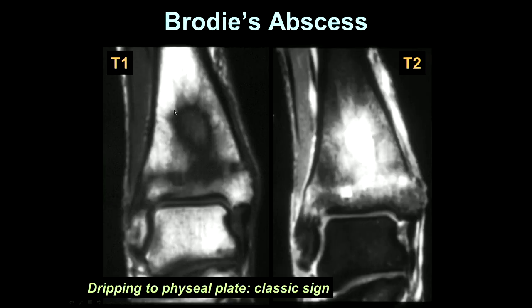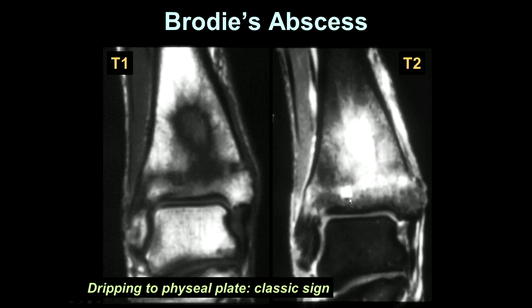Very often, Brodie's abscess has an appearance which drips to the physeal plate. Here is the lesion in the metaphysis, and here is this dripping appearance extending to the physeal plate, and that is very specific for Brodie's abscess.